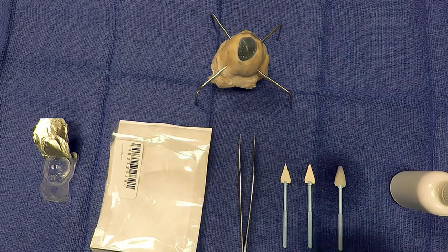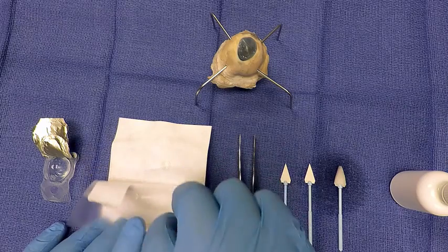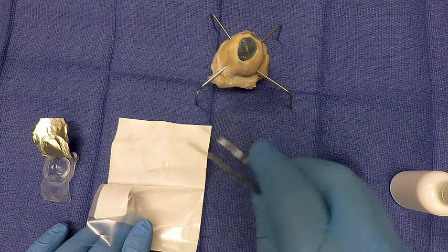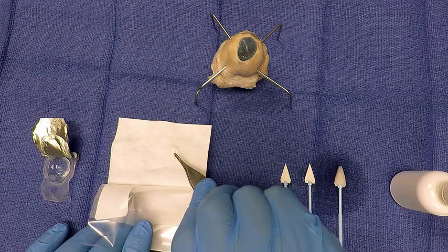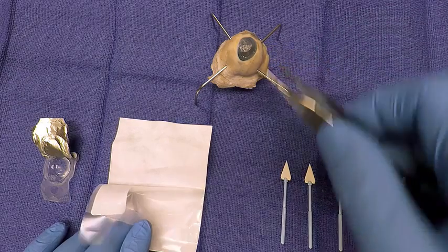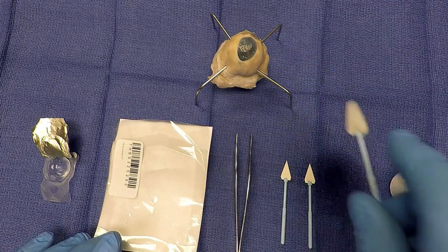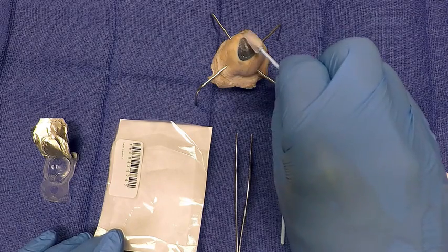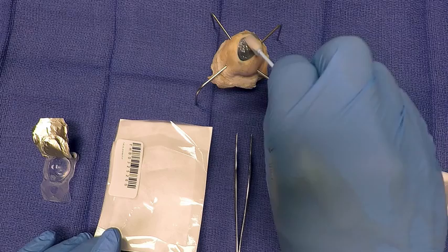Next, take the Eclipse Amniotic Membrane pouch and open it for the application process. Only open the pouch when you are ready to place the graft in the eye. Use the smooth-tip forceps to grasp the membrane and place it on the surgical site being treated. The Eclipse can be applied in either direction with no orientation issues. After in place, take your soft cell sponge and smooth out any raised edges of the graft. Make sure all edges of the disc are smooth and in place on the ocular surface.